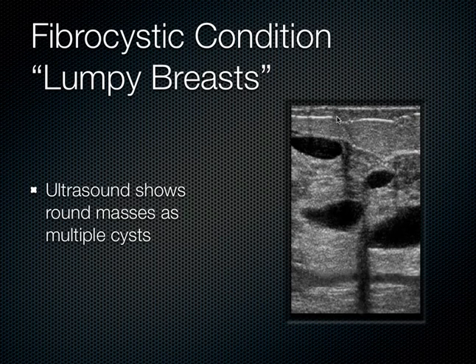The sound is going through this skin and then into this glandular tissue here, and it reaches this cystic structure, and then the sound is redirected. And so it goes through here, and then it gets redirected. And on the edges of that cystic structure, we get these shadows, lateral. Sometimes we call it lateral cystic shadowing, or refraction artifact. The sound is being redirected. So that's why we see these shadows here on the edges of these cystic structures.